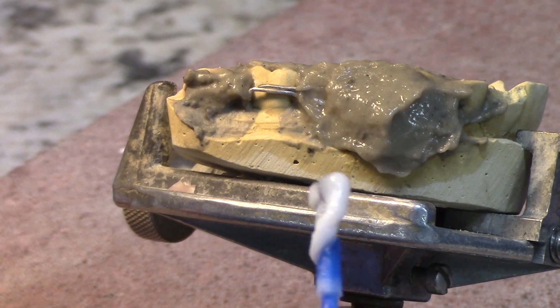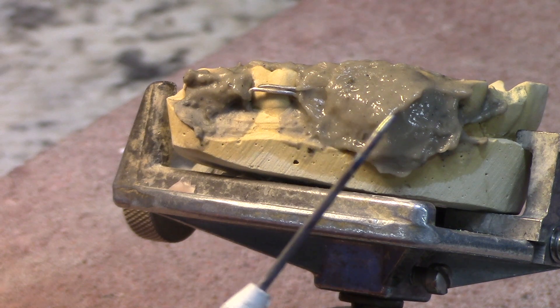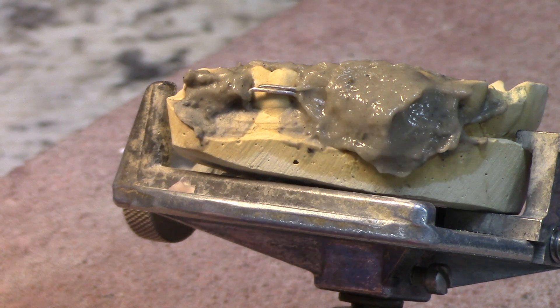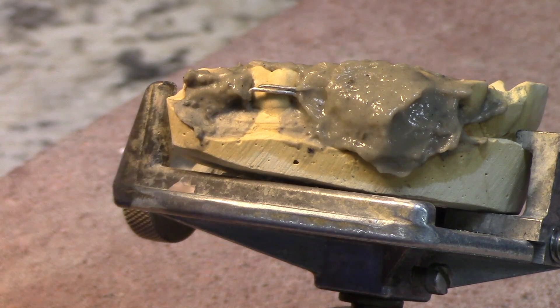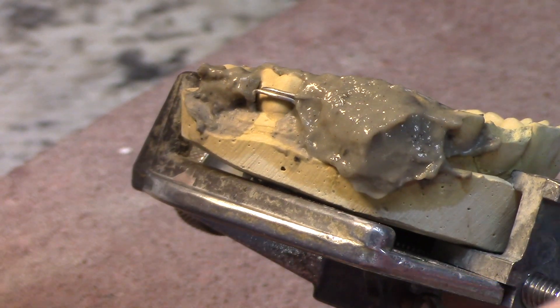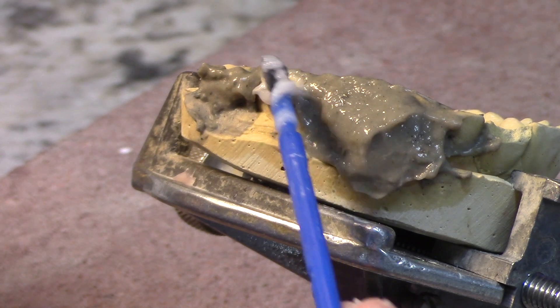I'm going to use my flux — clean flux — my titanium probe, and my nickel silver alloy solder. I've got this torch adjusted just as low as I can get it. Here we go — I'm going to fire this up.